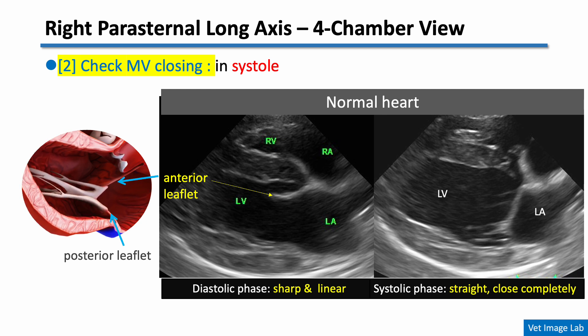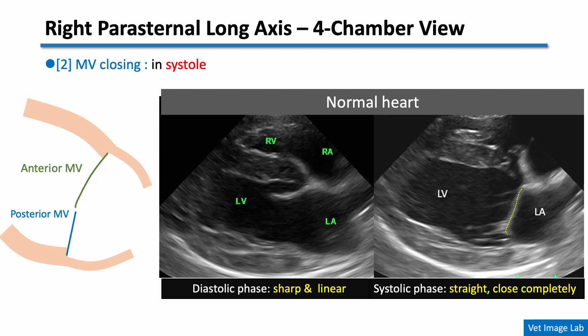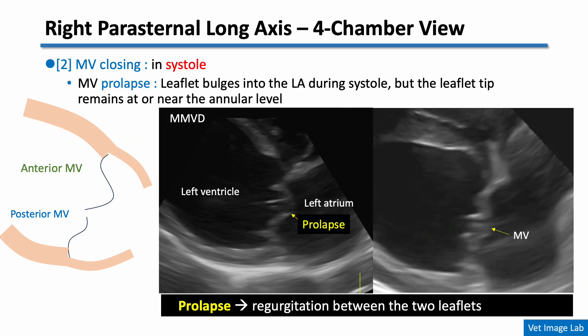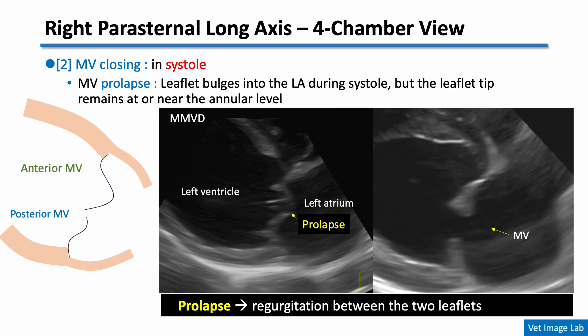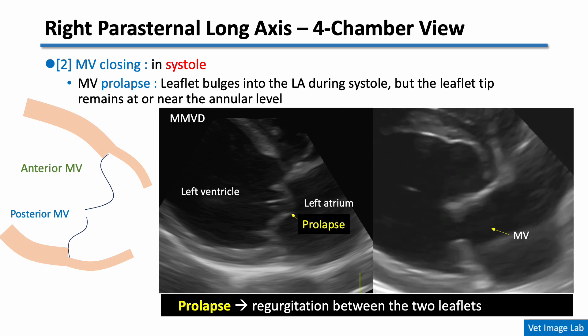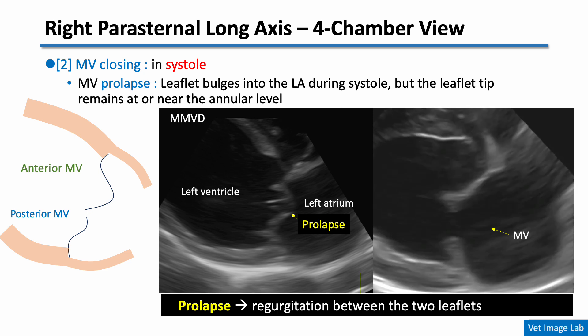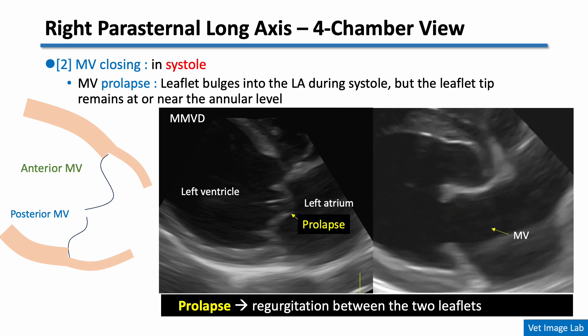Next, in the systolic phase, we evaluate whether the mitral valve closes properly. In a normal heart, the valve leaflets form a straight, continuous closure line, with no gap and no bulging into the left atrium. The anterior and posterior mitral valve leaflets co-apt tightly during systole, and the leaflet tips should meet at the annular plane without protruding into the left atrium. But in cases of MMVD, the mitral leaflet bows or billows into the left atrium during systole, while the tip still remains at or very near the annular plane. This finding is called mitral valve prolapse, and such incomplete coaptation creates a central gap, resulting in mitral regurgitation.